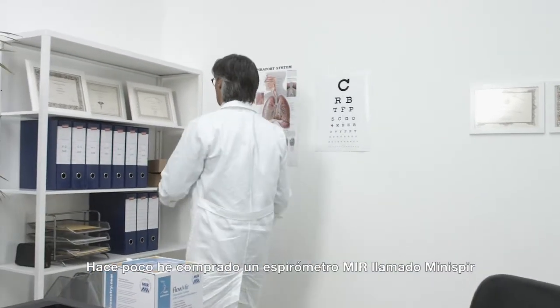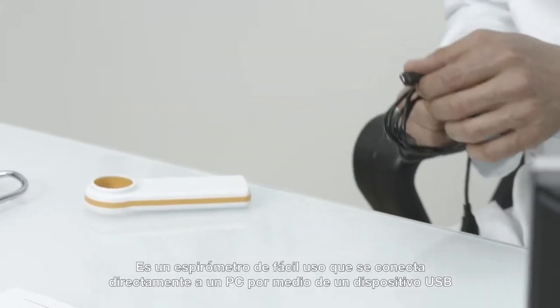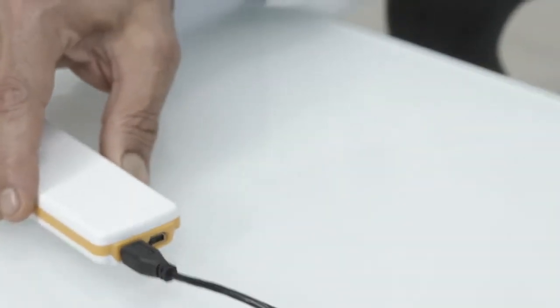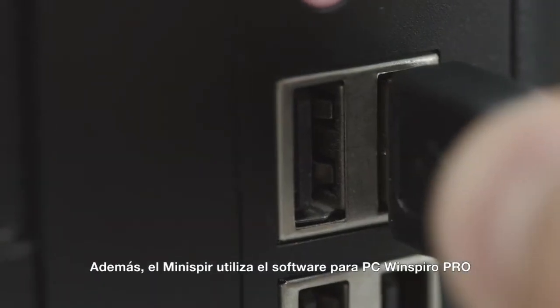Recently, I purchased another MIR spirometer called the Mini Spir. It's an easy-to-use spirometer which directly connects to a PC via USB. It doesn't require batteries. Also, the Mini Spir works with WinSpyro Pro PC software.